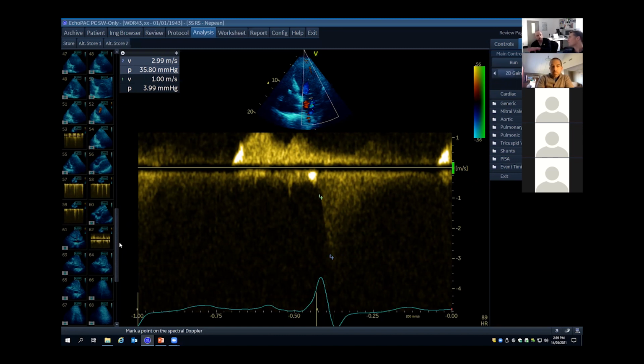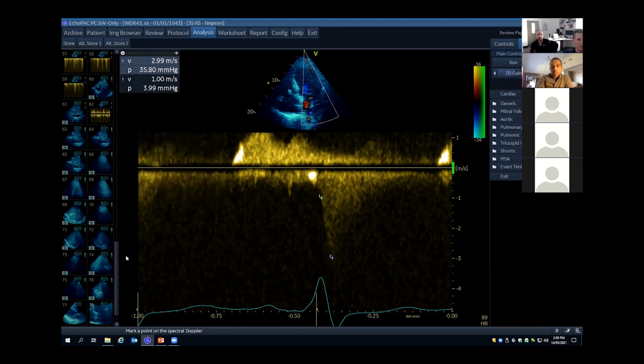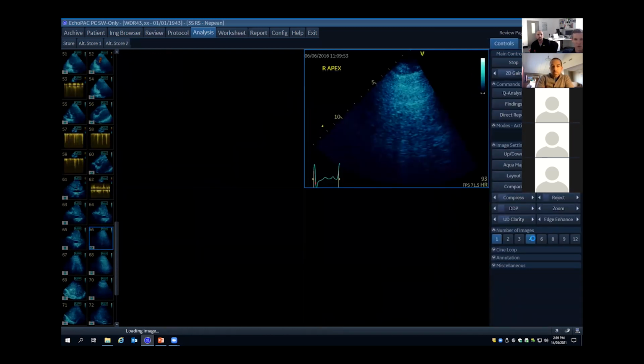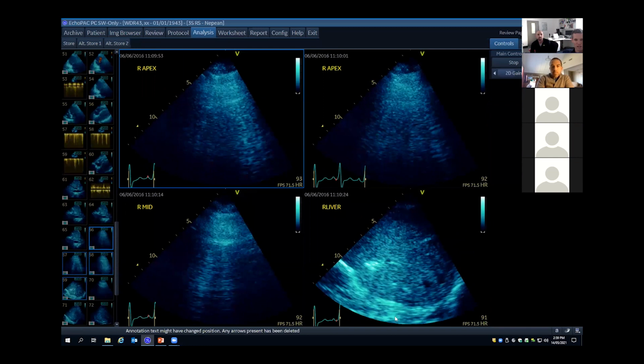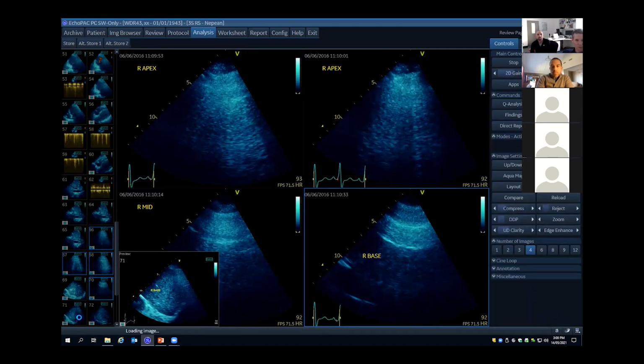So 4V squared of the Vmax, and minusing that from the systolic blood pressure gives the LAP. Very nice. What a great comment. All right, and I'd just say the last thing is if you're talking about left atrial pressure and they say, do you want any more images? I think calling for lung ultrasound would be fantastic.